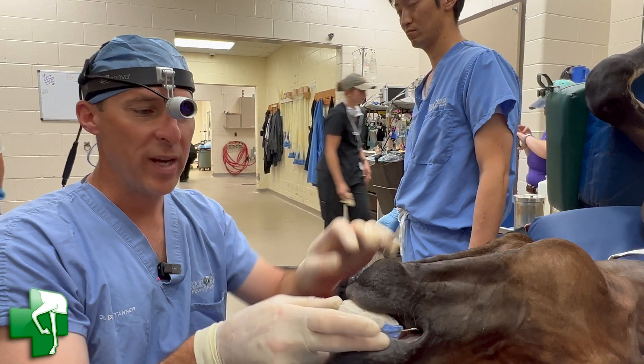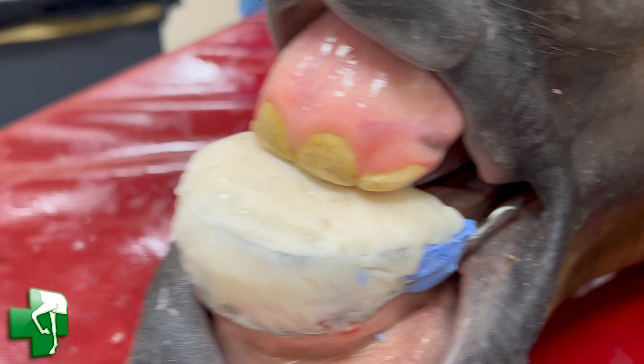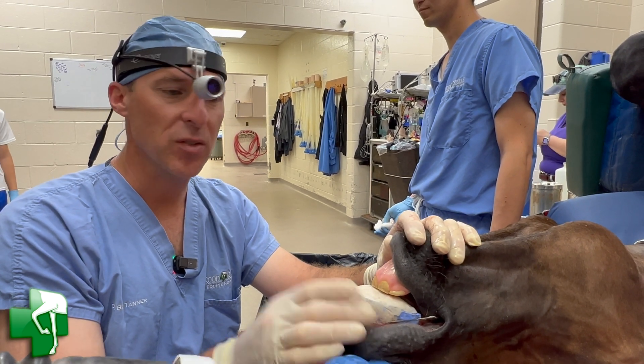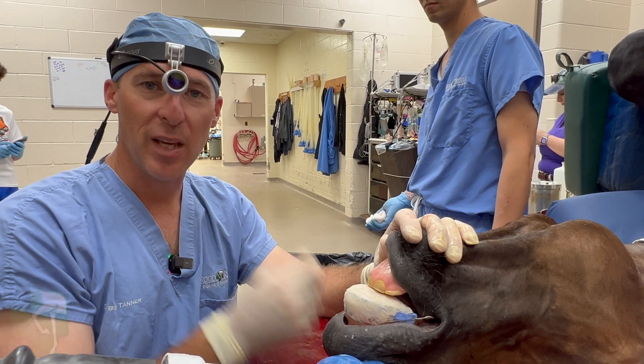The wires in place are retarding the growth of the maxilla while the mandible grows. This device will be on for up to six months, and at that point these teeth will line up with these teeth, and we'll take everything off.